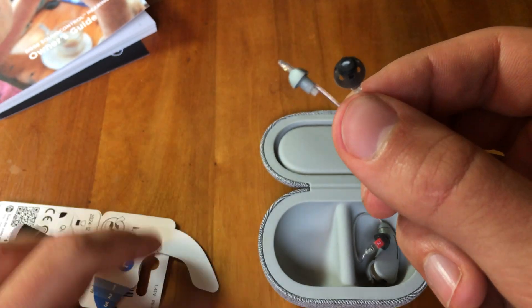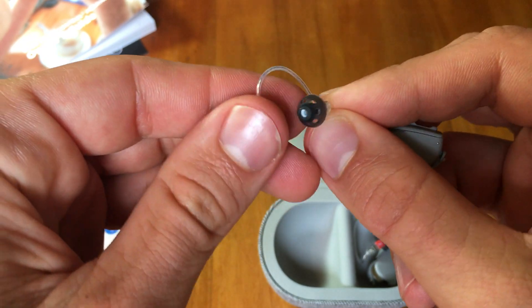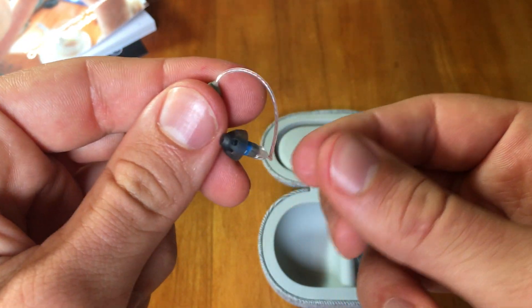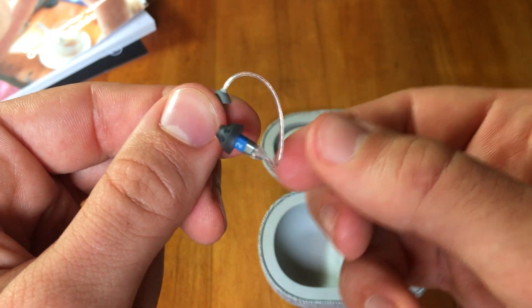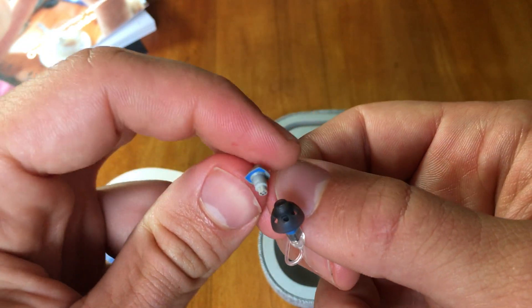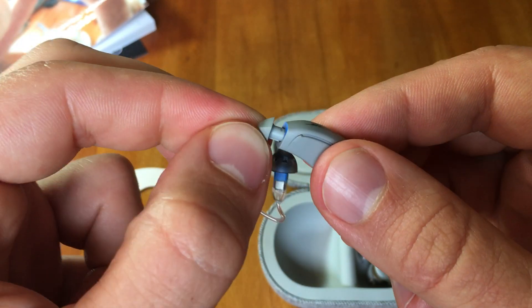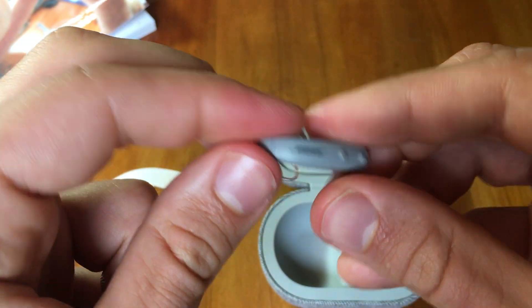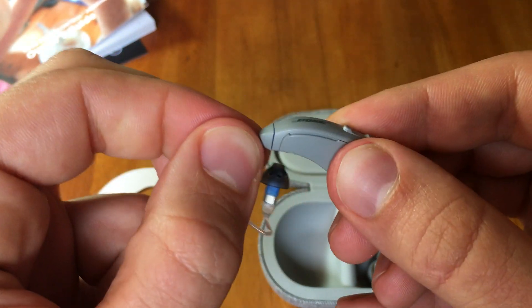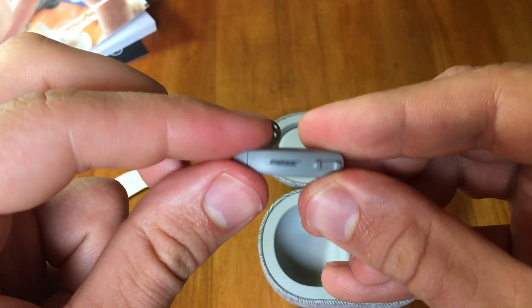This was receiver wire length number 2. If you have a smaller ear or a larger ear, you might be a better fit at number 1, which is smaller, or number 3, which is longer. You would pop off the left side and plug it back in nice and secure. To test that it's on properly, give it a little tug in the reverse direction and make sure you can hear well from the device.